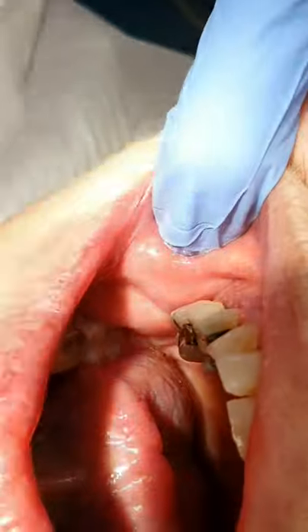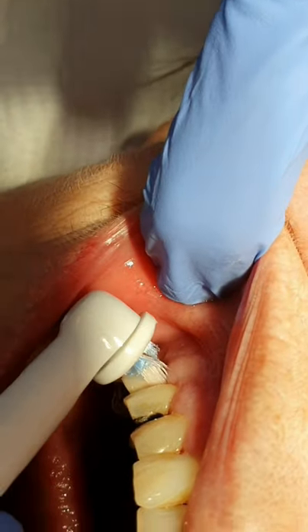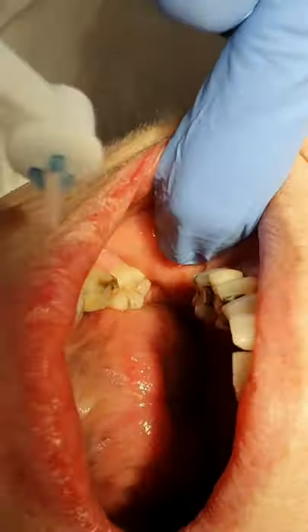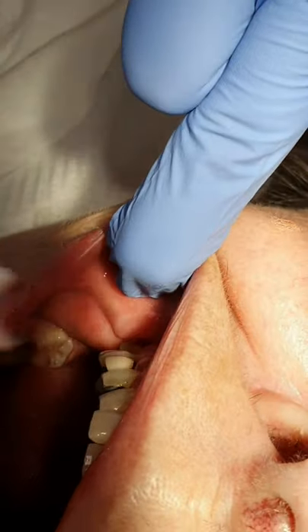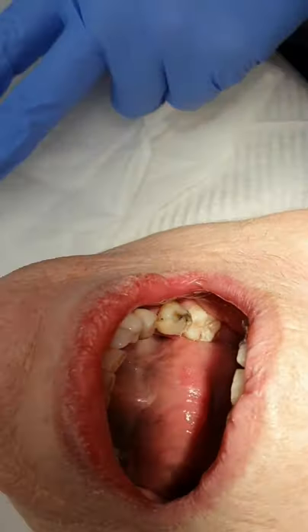I might put the light on it better, I don't know if that makes it worse or not. So you're just working it into these sorts of sites as well, really pushing it under the gum triangles and just disturbing where the bacteria live. On the back ones also, you've got your cheek to contend with, so it's just working it in. But the main area I want this lady to use it is on this pocket here. OK, I hope that's useful — let me know.